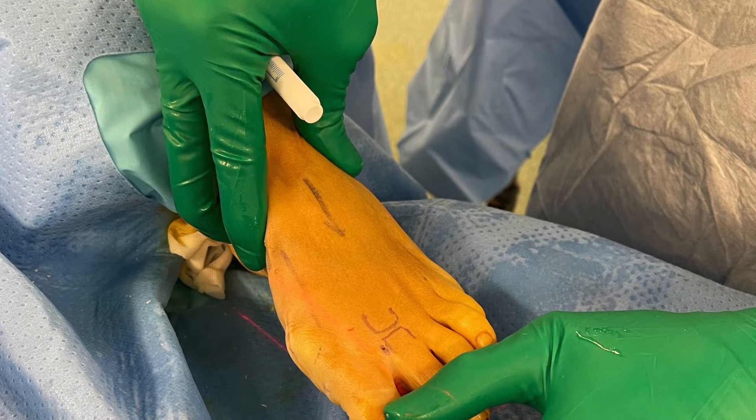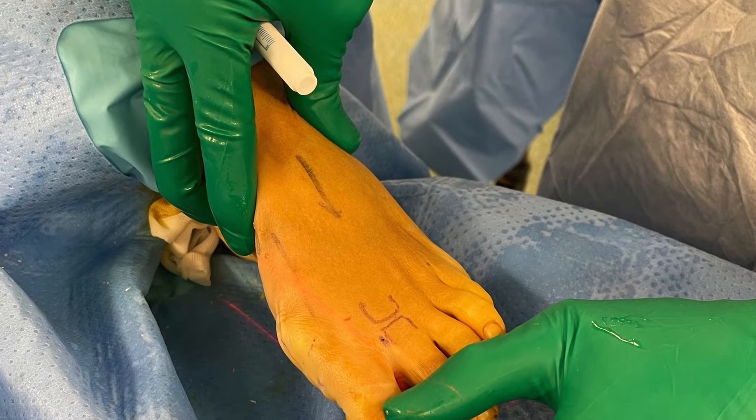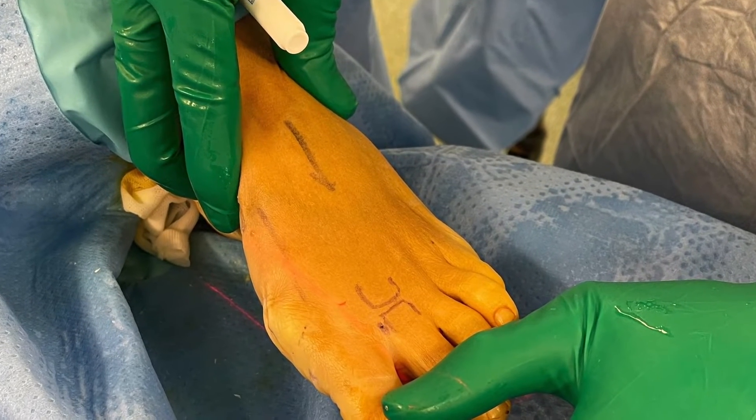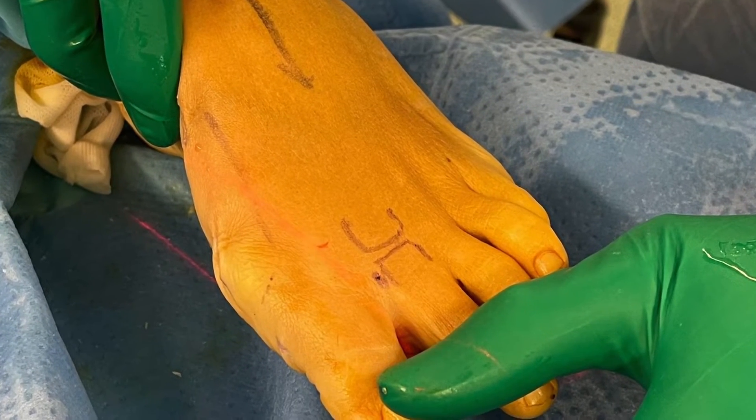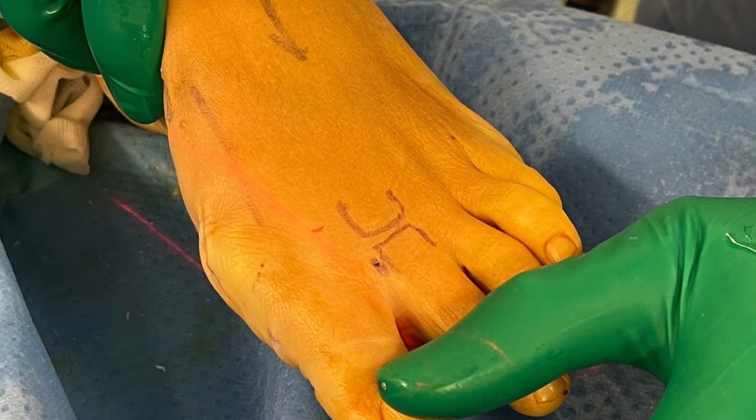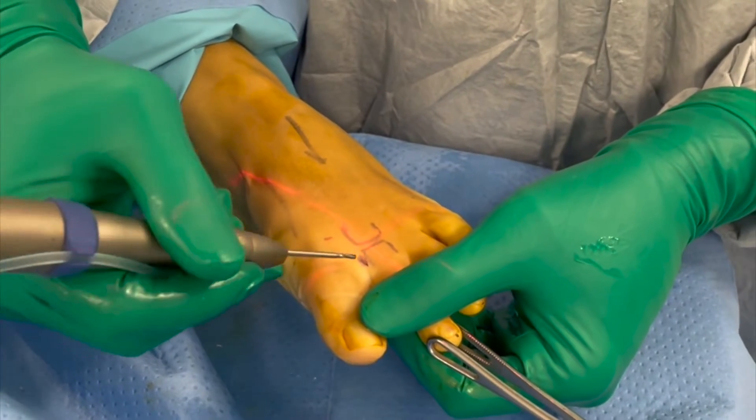The second toe is gently held with a gauze sponge holding forceps with the leg rotated to obtain an AP view of the proximal phalanx and identify the base of the phalanx. A 2mm incision is made dorsomedially just distal to the second metatarsophalangeal joint.